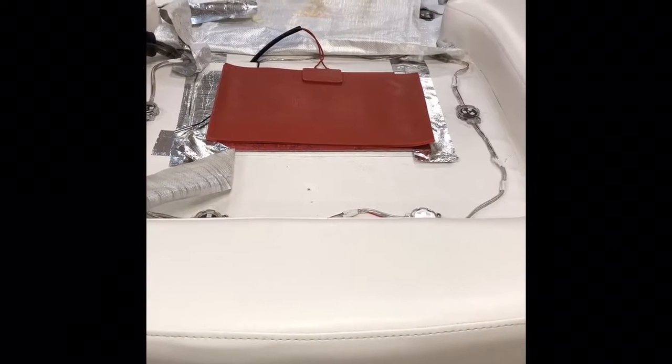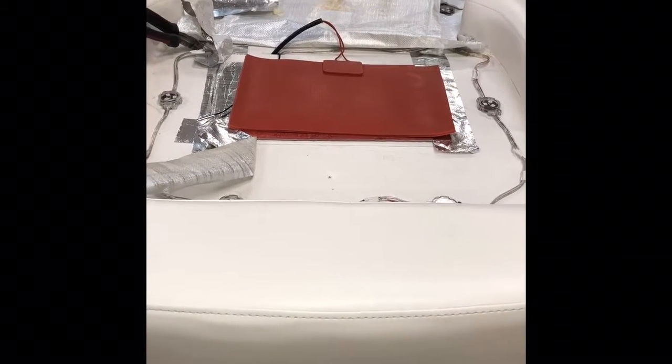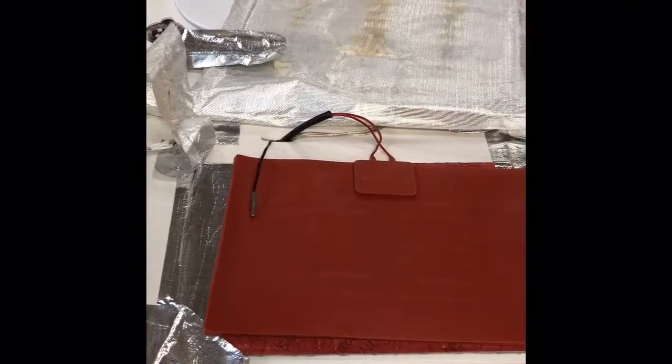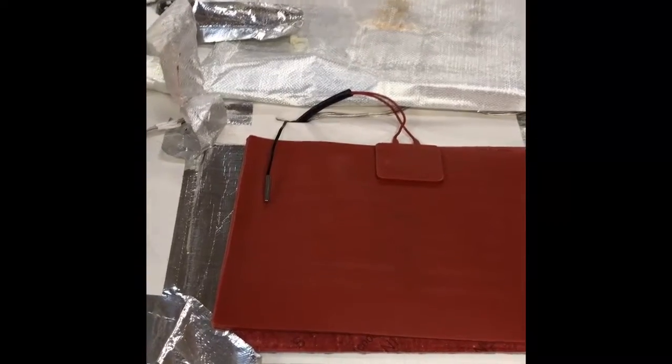I'll go ahead and show another video, probably the final troubleshooting on that bed if this tube doesn't remedy the situation. All right, the third and the final video on the DX multi-bed.